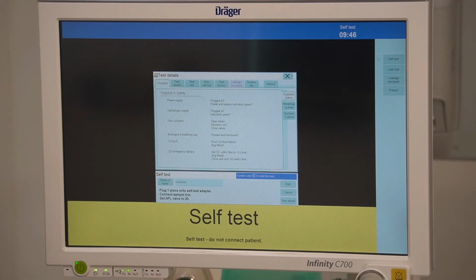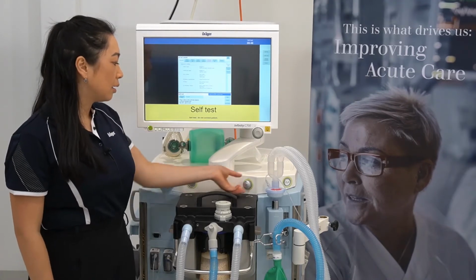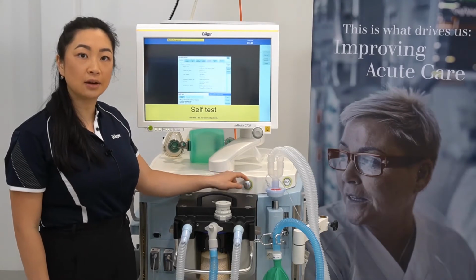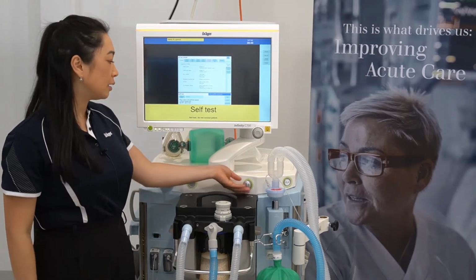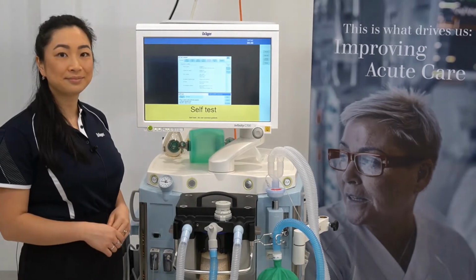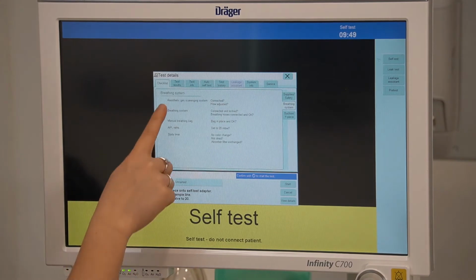To ensure the device is ready for the system test, work your way through the different checklists. To verify the power supply, ensure that it is plugged in and that the indicator is green. The LED light above the plug symbol indicates that you are connected to central power supply. The light indicator above the internal battery symbol indicates that the internal battery is charging. Should you lose central power supply, you will no longer see an LED light above the plug symbol.